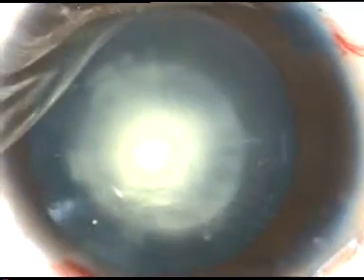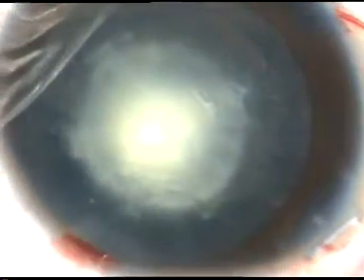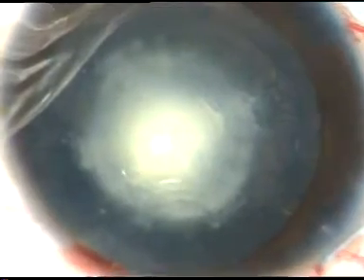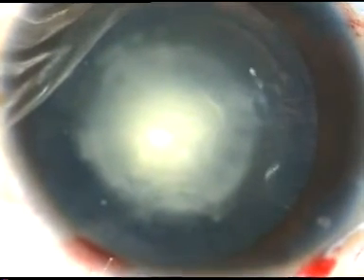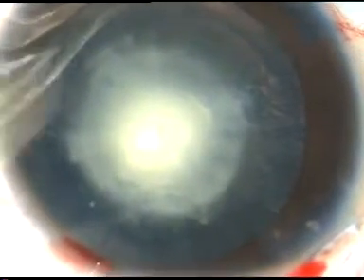Now I am doing hydrodissection with BSS and a 27-gauge cannula. The fluid wave goes from one side to the other side. I depress the nucleus and I see that the fluid wave comes along the equator anteriorly. This indicates that the cataract has separated from the posterior capsule.